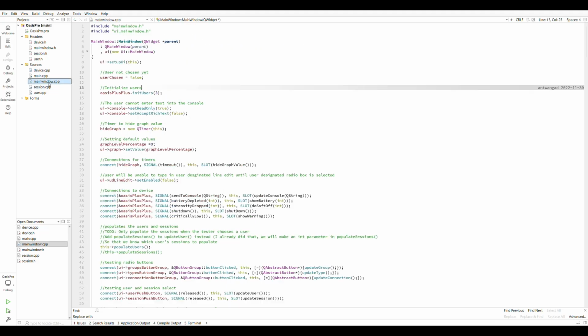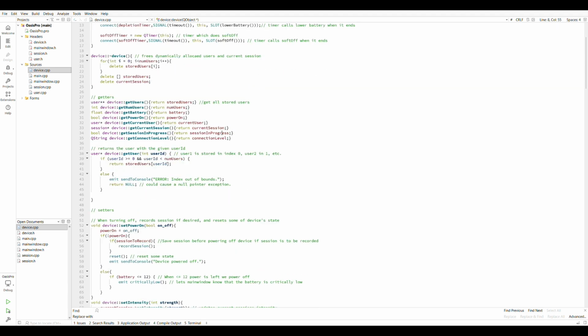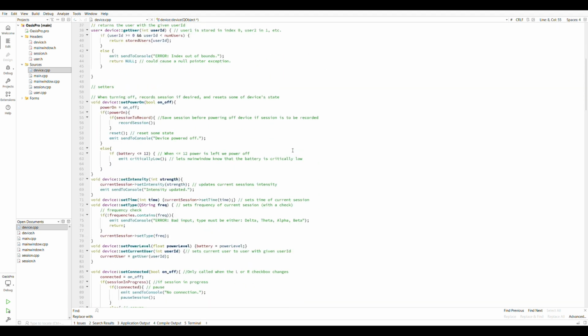Now, when you do certain events, signals will get emitted, which will tell the device to alter its state. So you can see some here. You can see a set power on function. This will get triggered by a signal, and then it emits its own signals as well. A send to console signal. So that's what you saw in the demo in the console. The device powered off when you turned it off because of this signal.